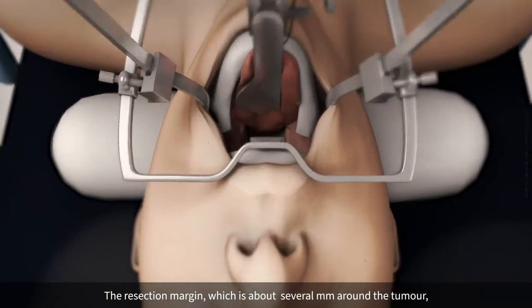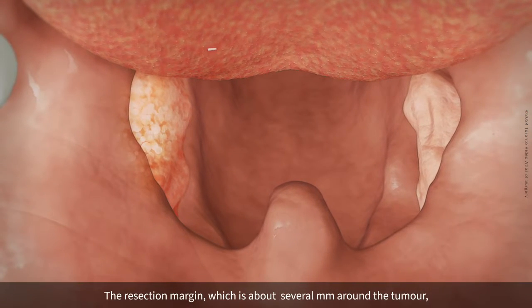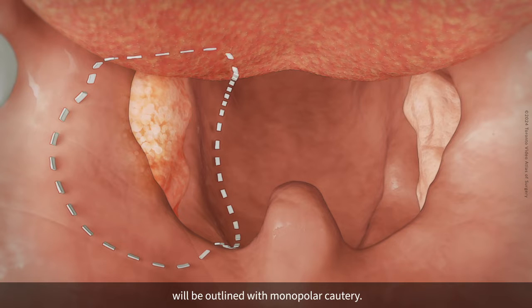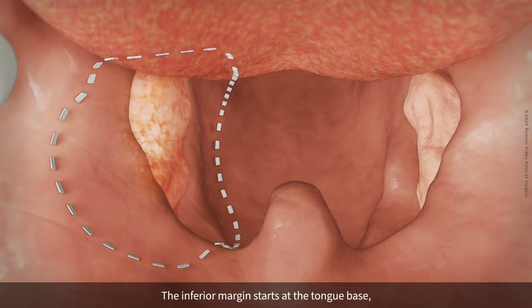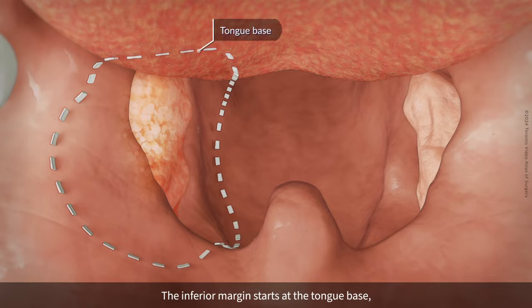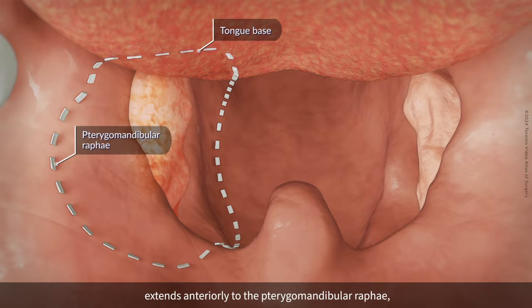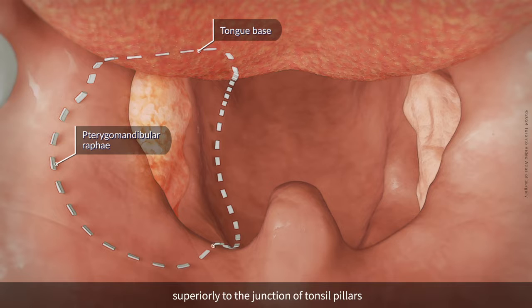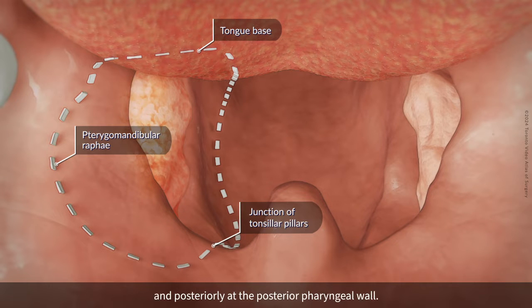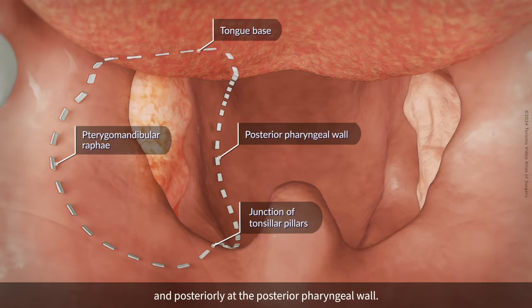The resection margin, which is about several millimeters around the tumor, will be outlined with monopolar cautery. The inferior margin starts at the tongue base, extends anteriorly to the pterygomandibular raphe, superiorly to the junction of the tonsil pillars, and posteriorly at the posterior pharyngeal wall.